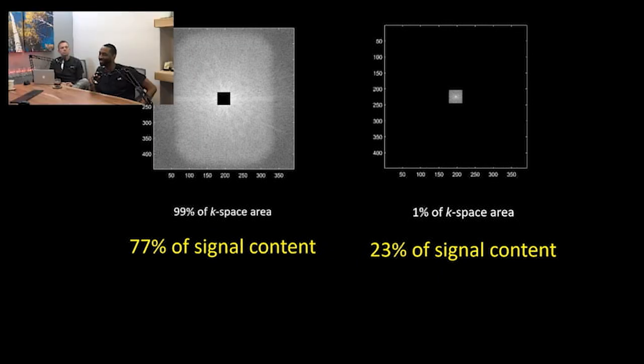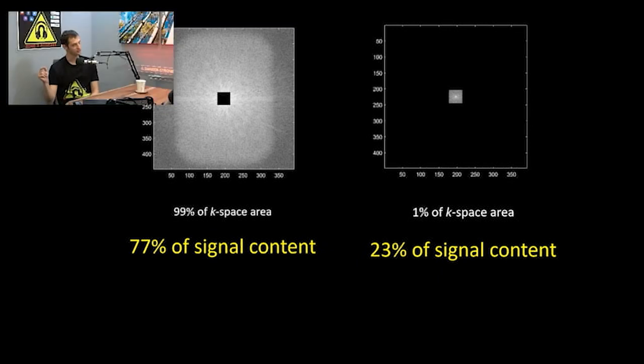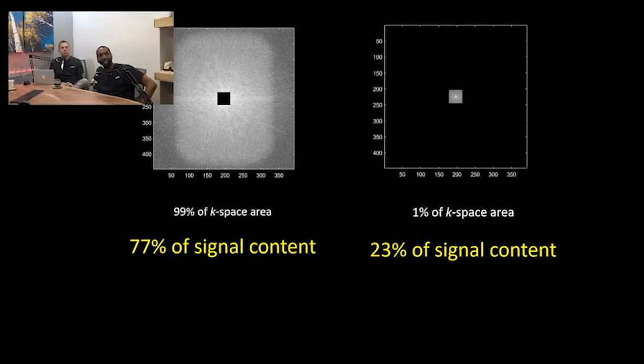I'm feeling a little more sharp on it because I just went through making this demo, versus if you asked me a week ago. Right, and I know there are all these different algorithms that help with the filling of Kspace to minimize scan time. And I know there are certain ways to fill Kspace that minimize motion, like doing it radially, actually, right? That helps with that too.